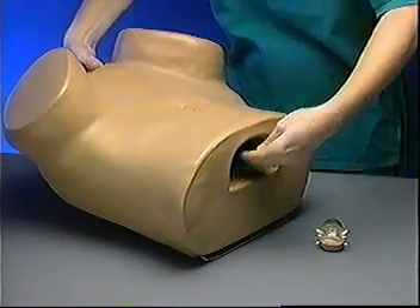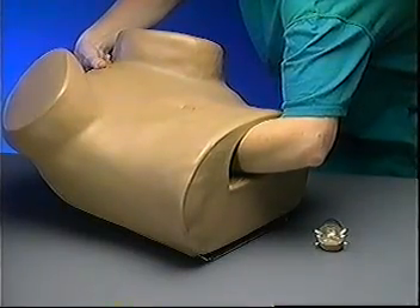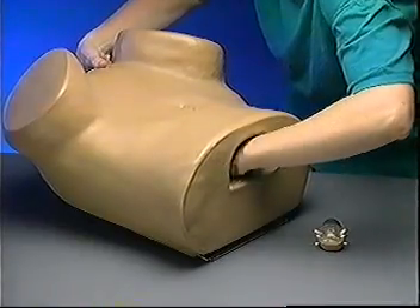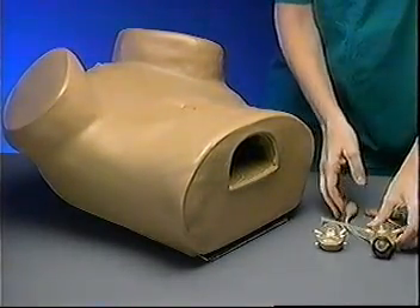Once you understand how ZOE's anatomical parts fit together, we suggest you change them through the opening at the top of the model. This helps to preserve ZOE's outer shell, as you will only have to remove it for demonstrations or to change the postpartum uterus.